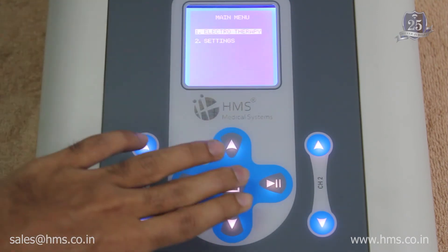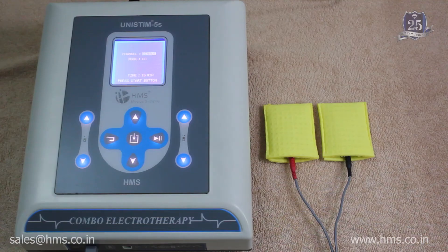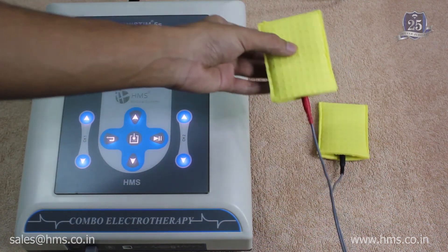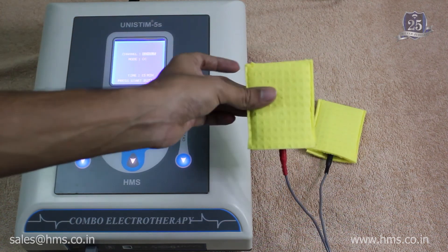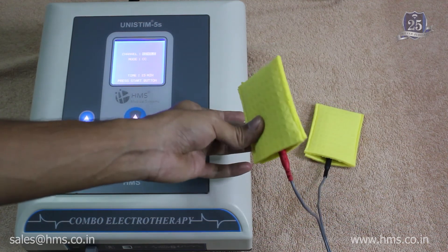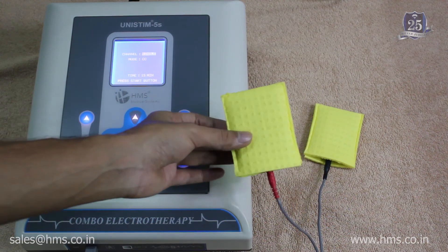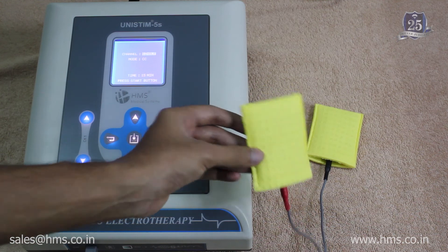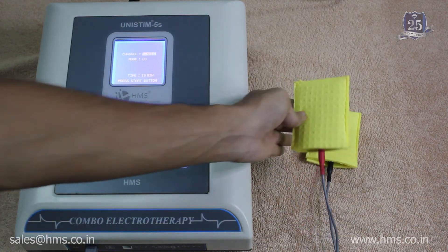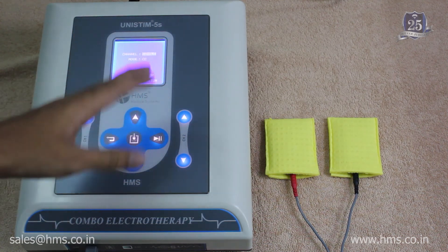Now we'll cover the safety features available with the machine. The electrode has been connected, and the sponge pouches are used to give wet treatment — an alternative to using gel, which is useful for patients who may be allergic to gels. Water is also an effective medium for treatment. Now we'll demonstrate the auto sensing feature.